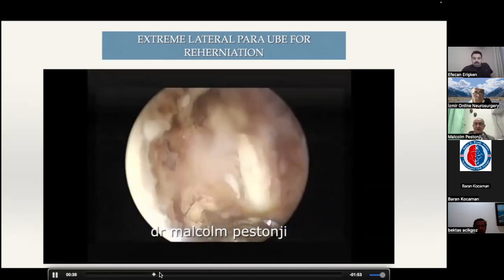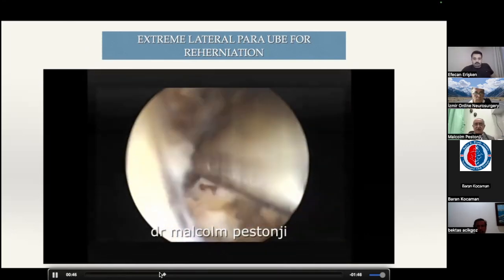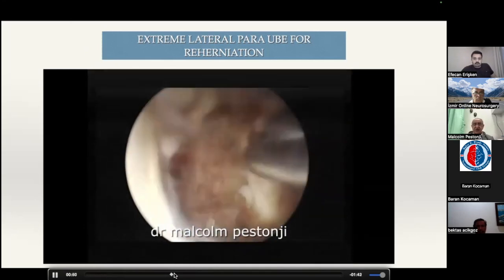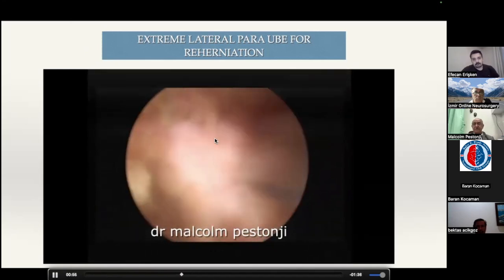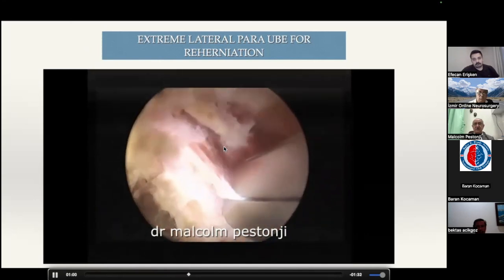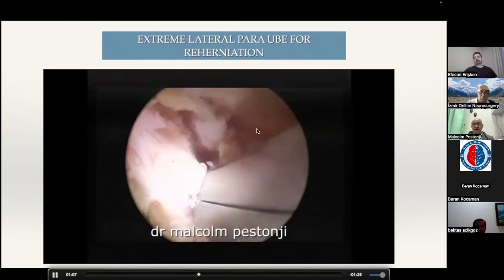I'm using an arthroscopic punch to punch away and remove all that mucky material, bony material, spiculated material that is just lying there underneath the root. That's the cause of his pain. So we clean it up. Then we come on the root. We have to free this root from here. We find a lot of fibrosis on the root. Slowly, slowly, we start stripping that fibrosis. I see the root is stuck to the top of the foramen. I want it to be freed.